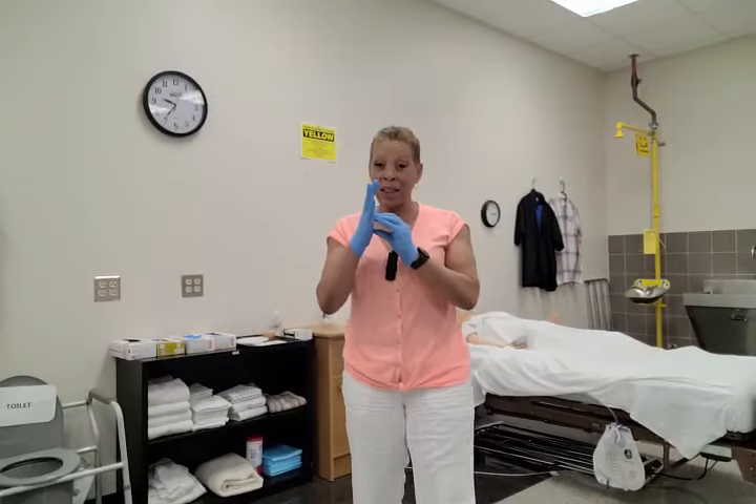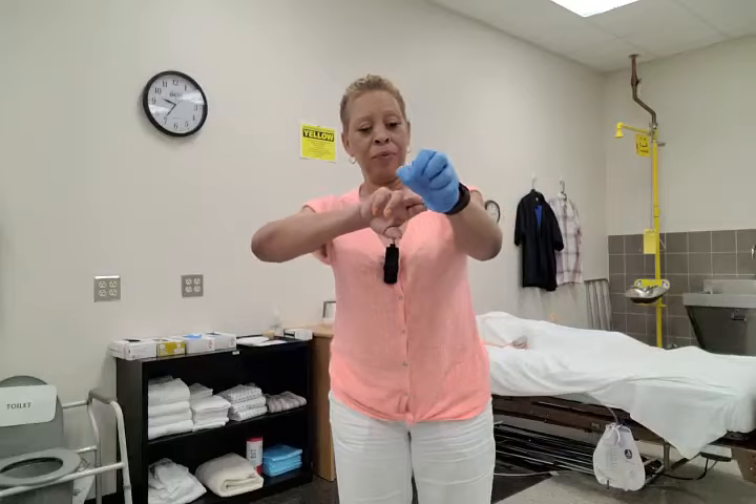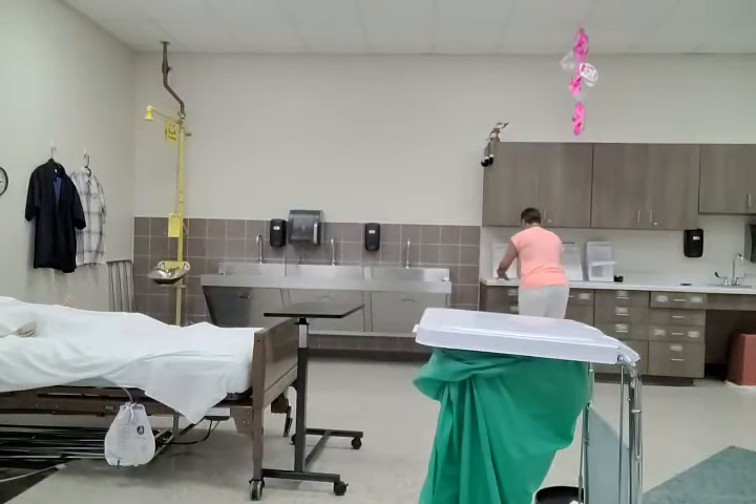I will remove my gloves without contaminating myself, immediately dispose of them into the waste bin, and immediately verbalize washing hands. Now I need to record — so wherever the measurement sheet is, I'm going to go and record my measurement.